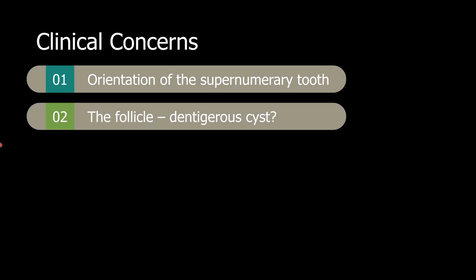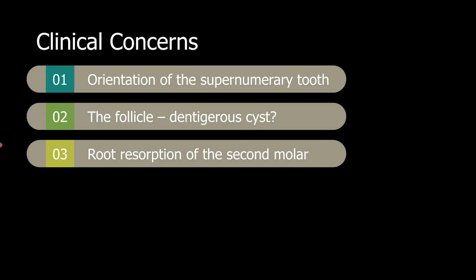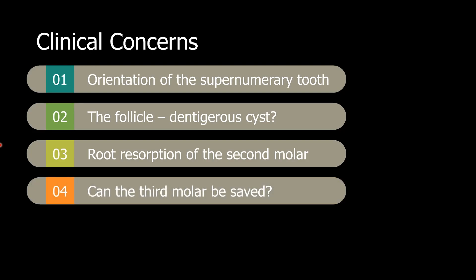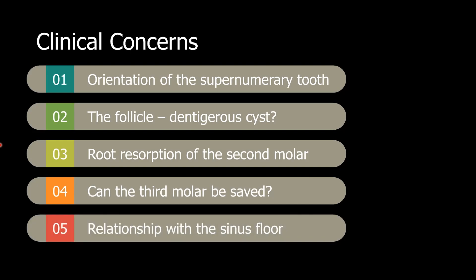We have several clinical concerns discussed about this radiograph. First, we want to know the orientation of the supernumerary tooth or the odontoma — whether it's closer to the buccal cortical plate or closer to the palatal cortical plate. The second concern was the follicle of the supernumerary tooth as well as the follicle of the third molar — if the follicle is large, can it be a dentigerous cyst? We are also worried about the root of the second molar and whether it is resorbed by contact with the third molar crown. We also want to know if the third molar can be saved, and whether the third molar is in contact with the sinus floor and the status of the sinus floor.